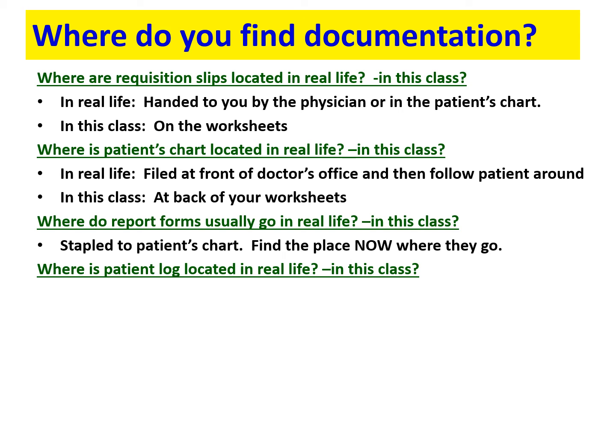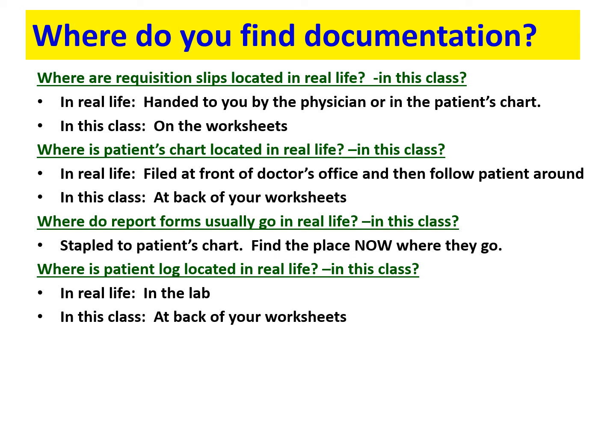Okay, now let's talk about that patient log. In real life, there is either an electronic patient log that is located inside the hospital or clinic's computer system, or you can have a 3-ring binder located in the laboratory that's the patient's log. Sometimes you can be partly electronic and part written record.